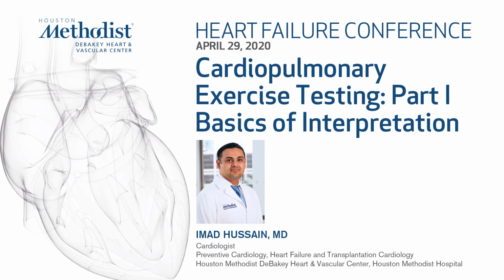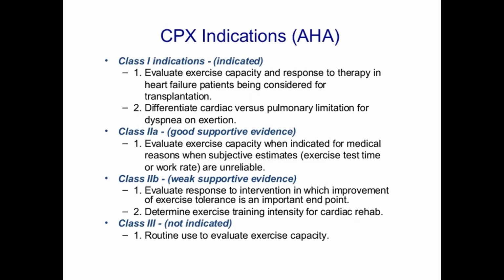Let's get started. I don't want to get into the details in this session for the indications, the prognostic value of CPET, and the algorithms that we can use to give exercise prescriptions, lung resection surgery. Those are things that I'll cover in either session 2, or if we can't cover them in the cases, then we'll have to have a third session going over prognostication and utility of CPETs.